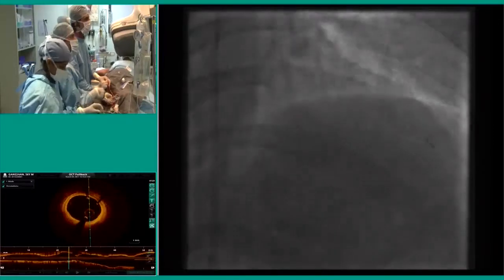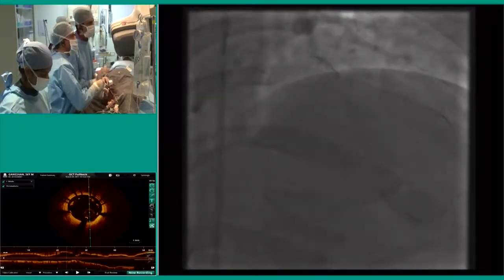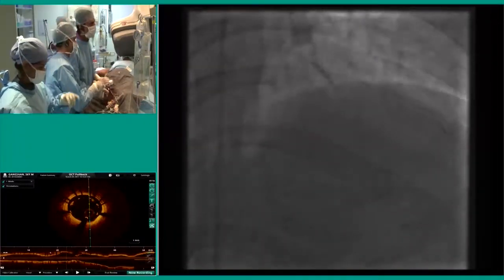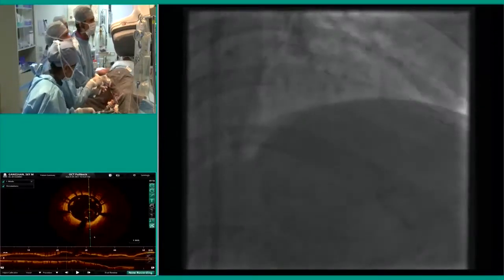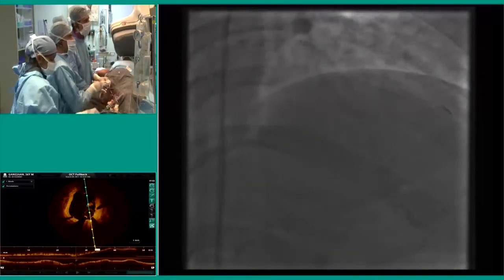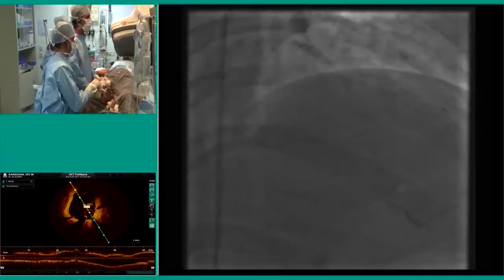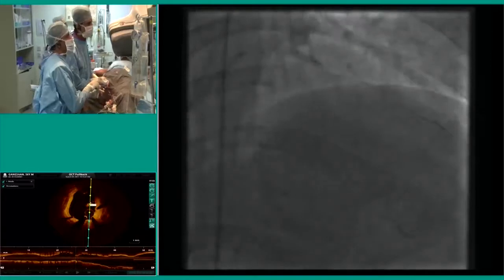I guess the main lesson here is that the stent needs some more work, and that's what you're actually doing, right? What size balloon are you using now? I'm using a 3.5. So I went 12 atmospheres distally, 16, and going more proximally, 18.